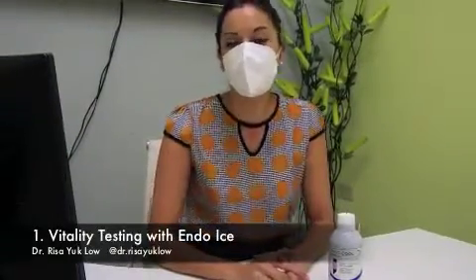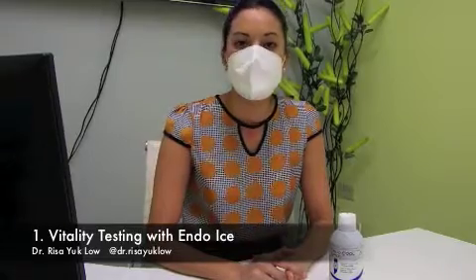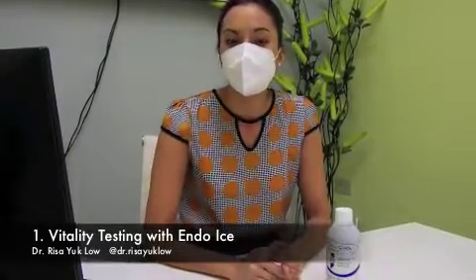Hi, good day, my name is Dr. Urisa Yaklu and I'm one of the dentists here at Gentle Dentistry, and today I'm going to talk to you about pulp sensitivity testing, what we call endo-ice, and what it is used for is to determine the health status of a tooth. It can determine if it's alive, if it could be saved with a filling, if it's on the way out or dying, or if it's a dead tooth.